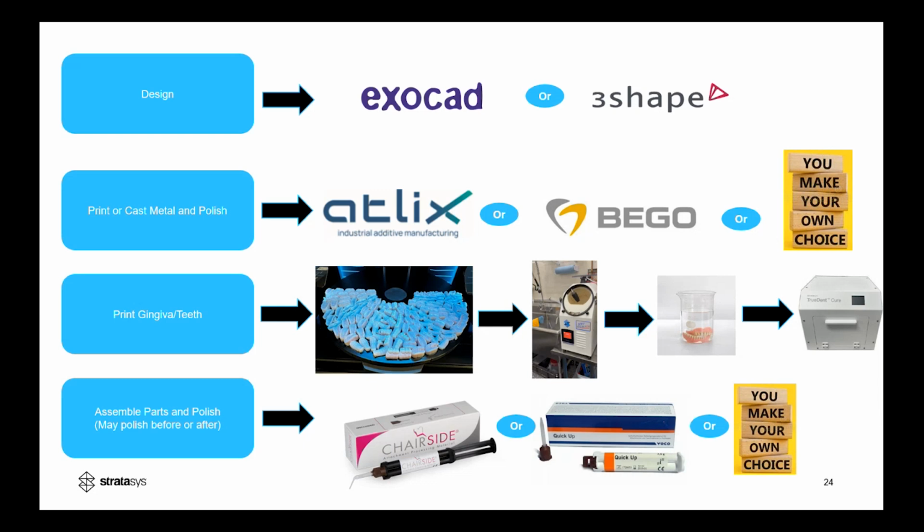Thank you, Ken. We do have a question, and I'd like to direct it to you because you're doing this actively with your experience. What are you using to adhere the frame to the TrueDent? I am currently using the chairside material that you see on the screen right there. And I find that it works really well.